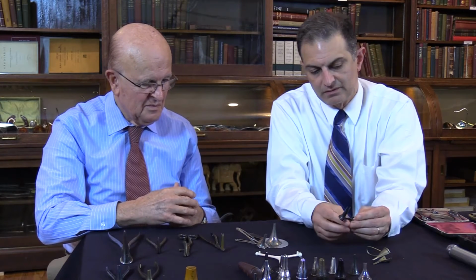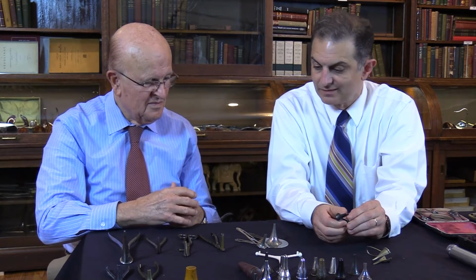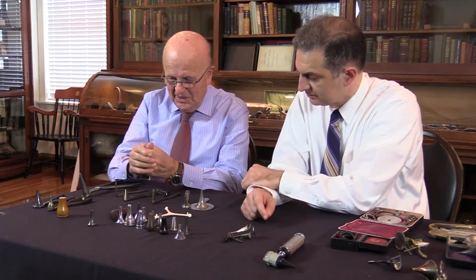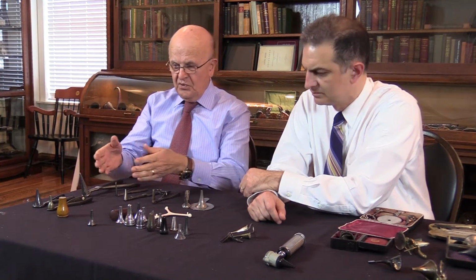But these aren't. We don't see too many items like this today in our practices. Yeah. Well, the other thing, the bivalve ear speculum is something that we don't use now. We use it as a nasal speculum, but that was something. Actually, the ear speculum started with the bivalve.